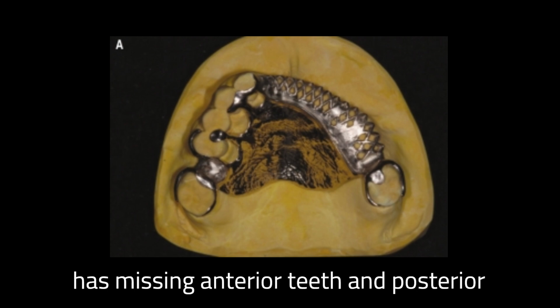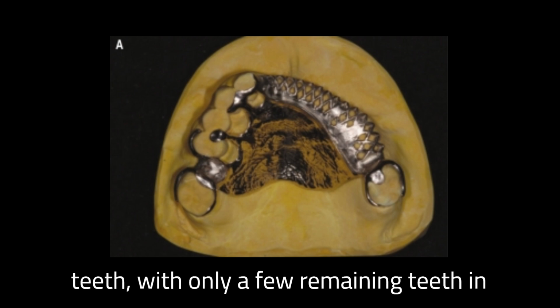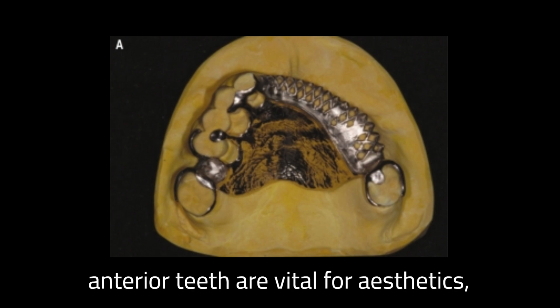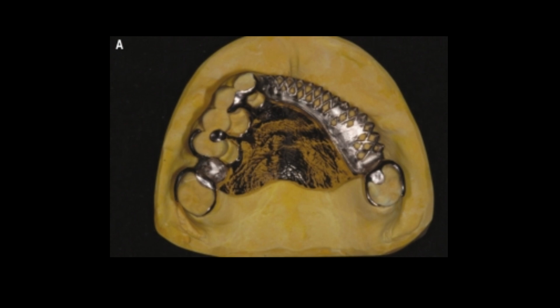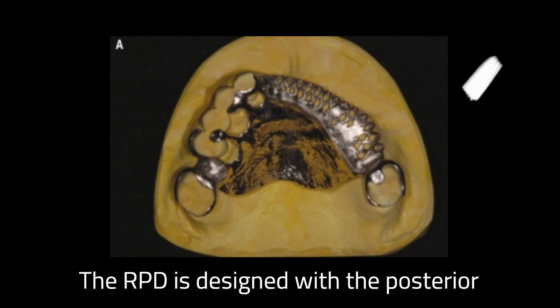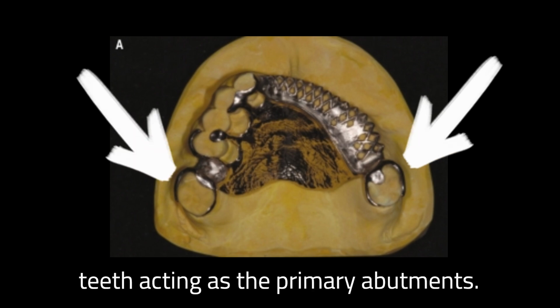A patient has missing anterior teeth and posterior teeth, with only a few remaining teeth in the anterior and posterior segments. The anterior teeth are vital for aesthetics, and traditional clasps would be unsightly. The RPD is designed with the posterior teeth acting as the primary abutments.